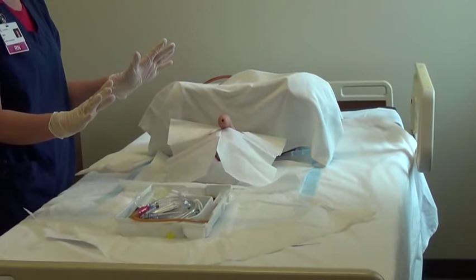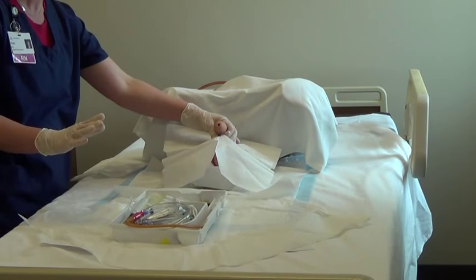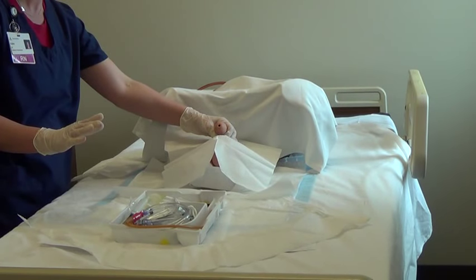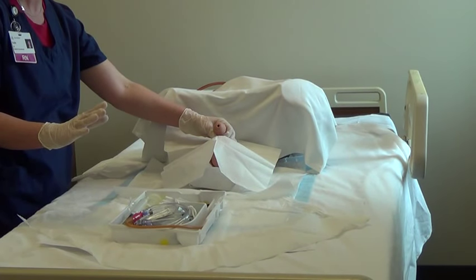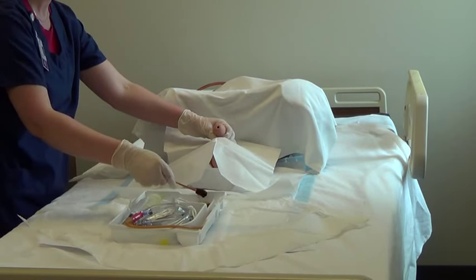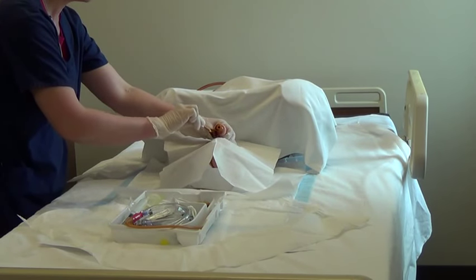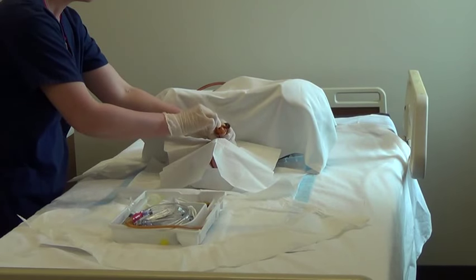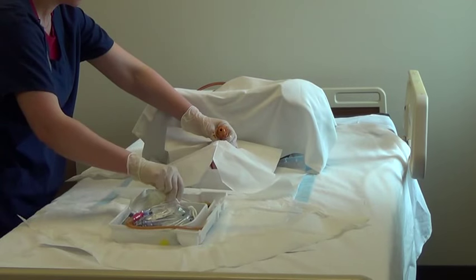For males, with your non-dominant hand, elevate the penis, holding it perpendicular to the body without compressing the urethra. This hand is now contaminated and is committed to non-sterile activity. With an uncircumcised patient, the foreskin should be gently retracted. Using your dominant hand, cleanse the penis with the povidone iodine saturated foam swab sticks. Twist the swabs to remove them from the tray. Start at the urethral meatus and use each swab stick one at a time, cleansing in a circular motion.